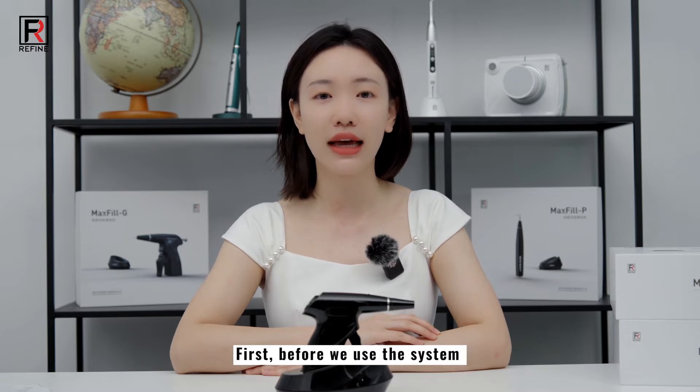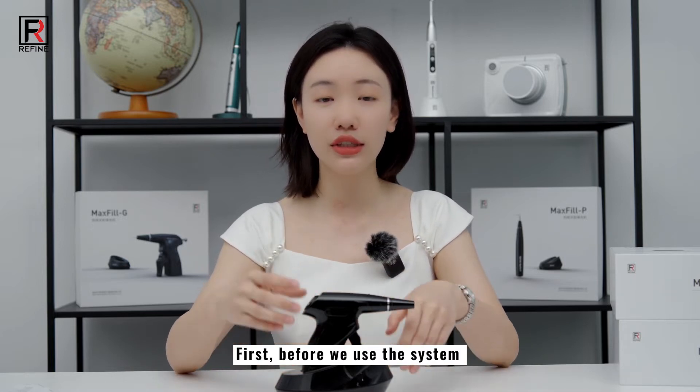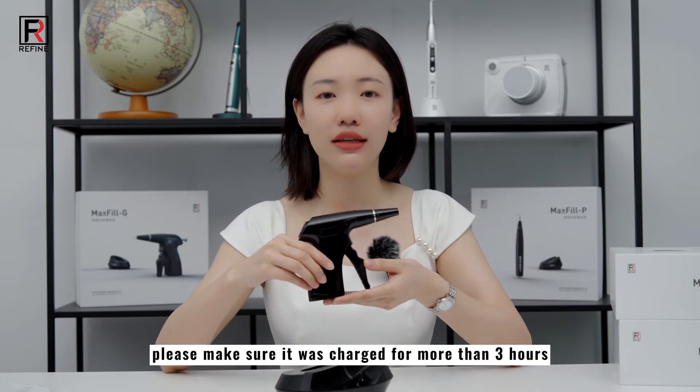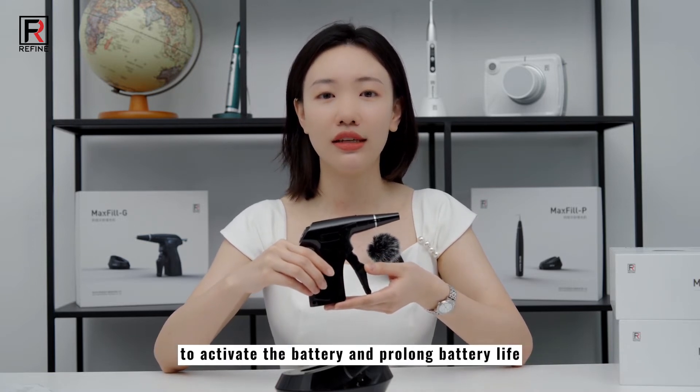First, before we use the system, please make sure it was charged for more than 3 hours, to activate the battery and prolong battery life.